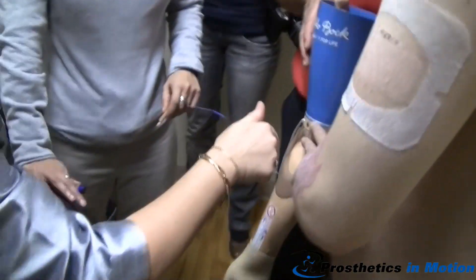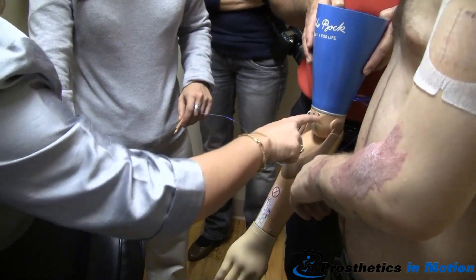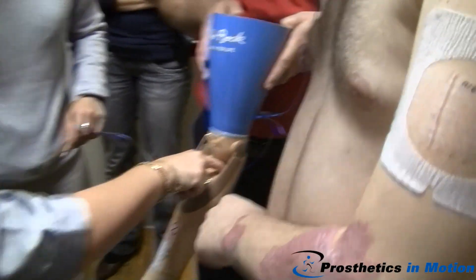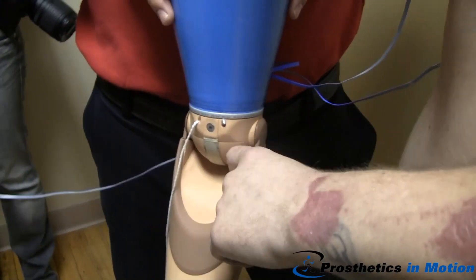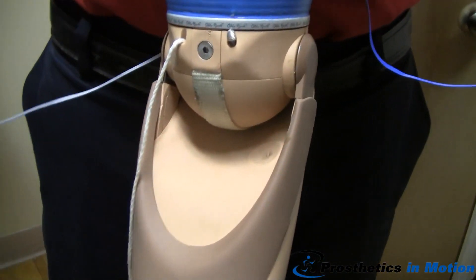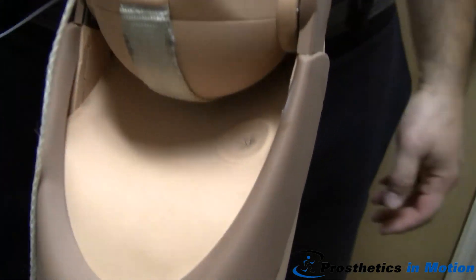Now push it in and let go. Did you hear those beeps? That's on/off. There's a charging port right here too. Just like you have a cell phone, right? You charge it every night — same thing with your arm. Plug it in every night just like you do yourself and you're good to go.